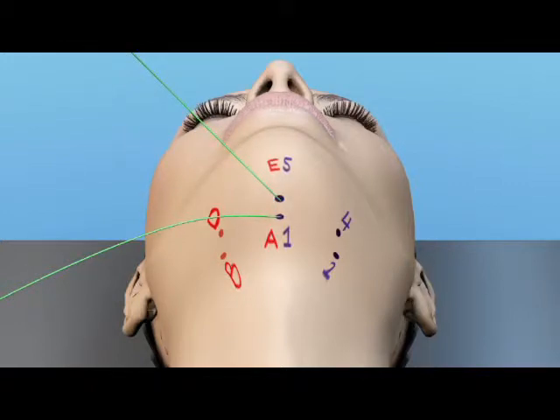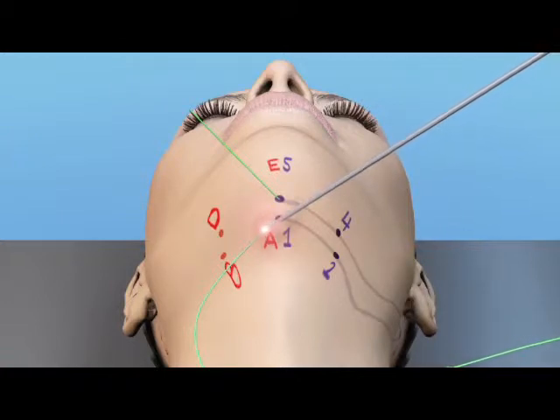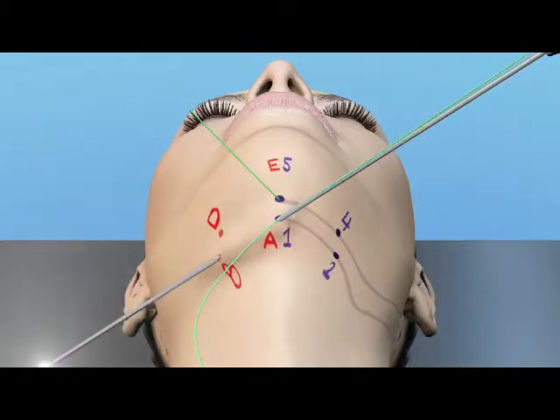This suture will be used to carry on the operation by placing the trampoline platysmoplasty anterior to the neck-defining suture. Remember, do not cut the suture. It'll just be tied here when both limbs are threaded in the subcutaneous space, and then the suture will be continually weaved anteriorly using the trampoline platysmoplasty procedure.